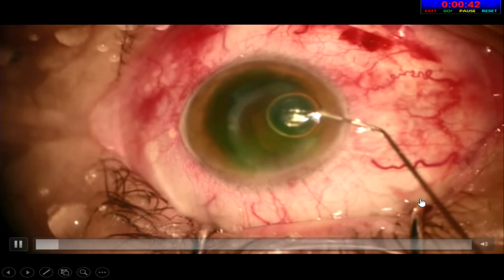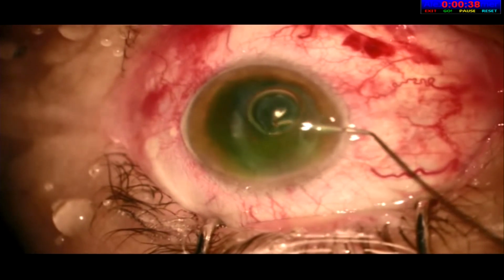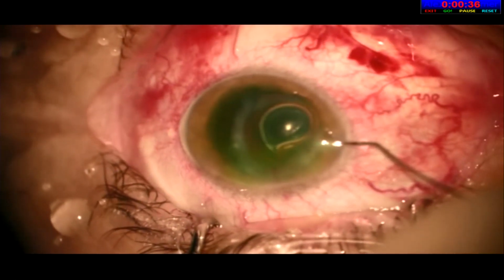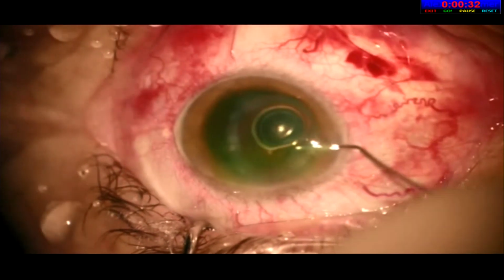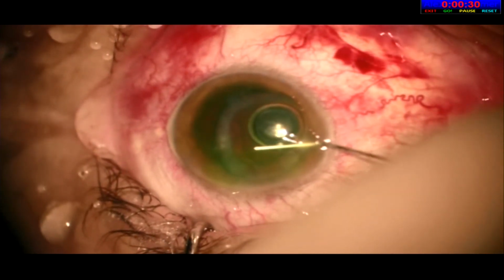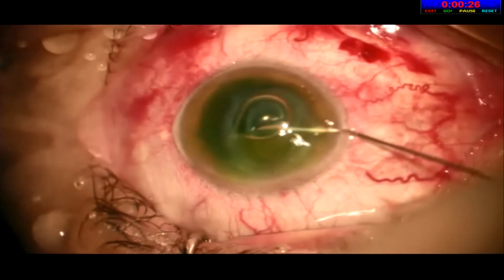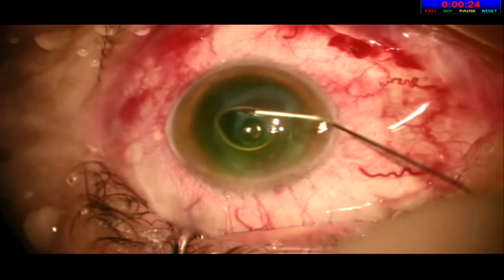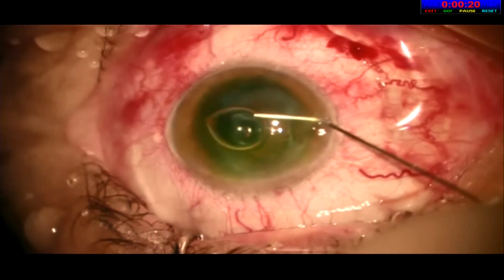So firstly, an air bubble. Now this separates the graft and the recipient stroma, and then it creates space for you to use jets of fluid to displace the rest. And also you can use the air bubble by brushing it from above to detach the rest of the graft.